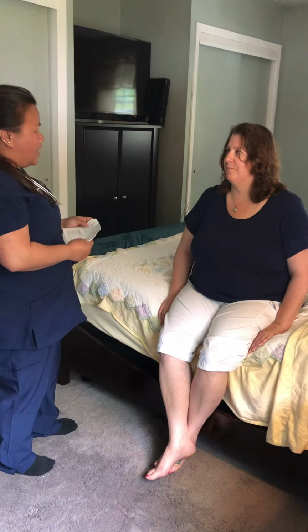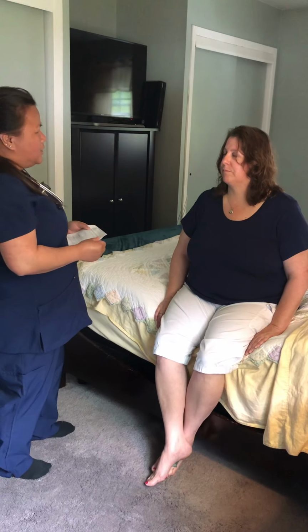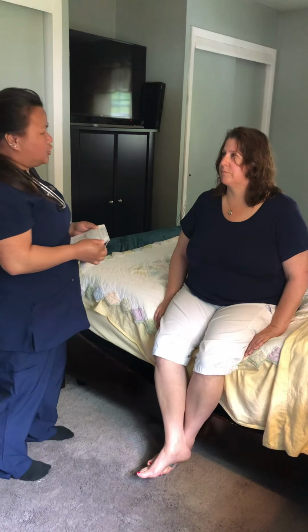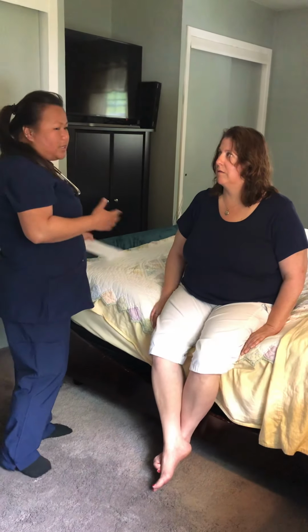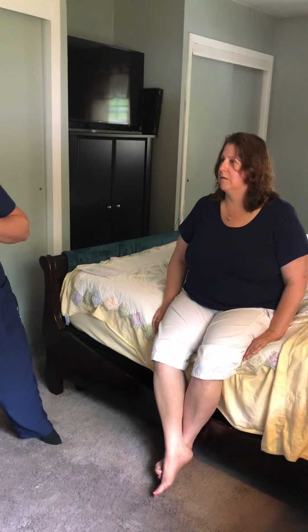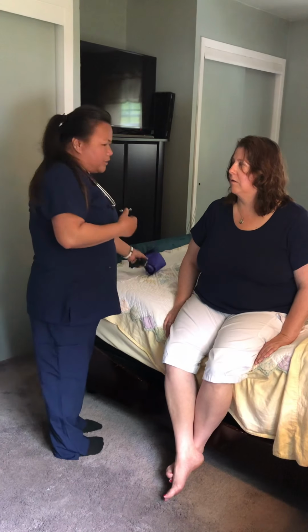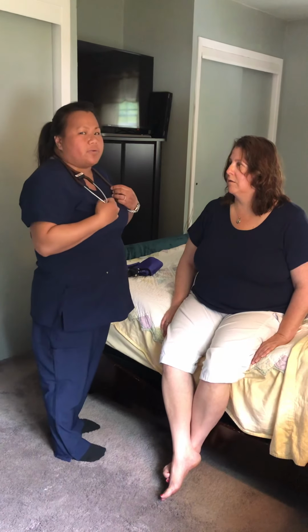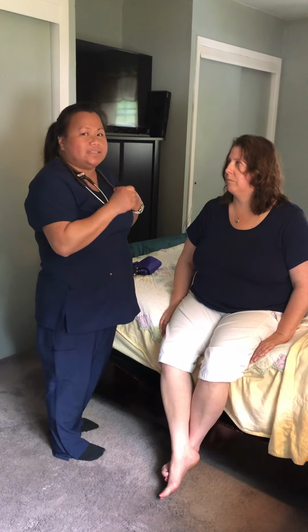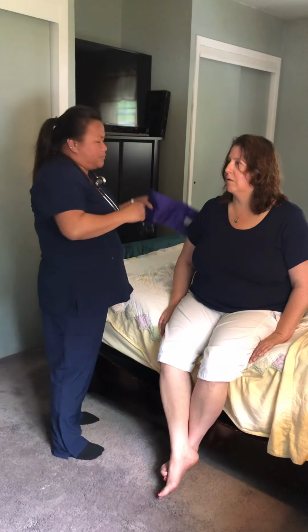8/12/1966. Okay. Looking at my patient, I can see that she's not in any distress right now, and she's A&O times 3. So we're gonna check out her vital signs to start with. First, we're gonna check her temperature. I don't have a thermometer right now, so we're just gonna assume that I did check her temperature, and then we're gonna check her blood pressure.